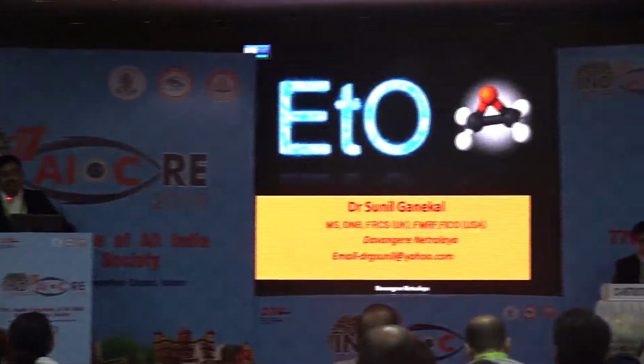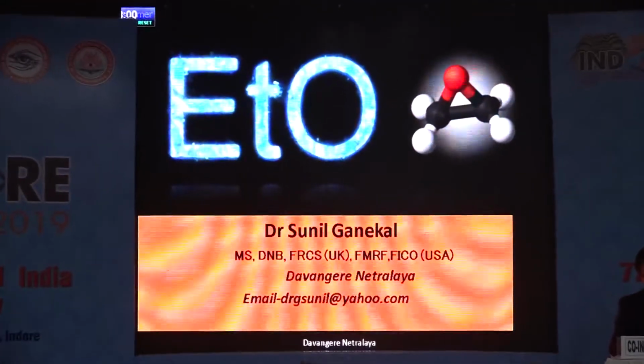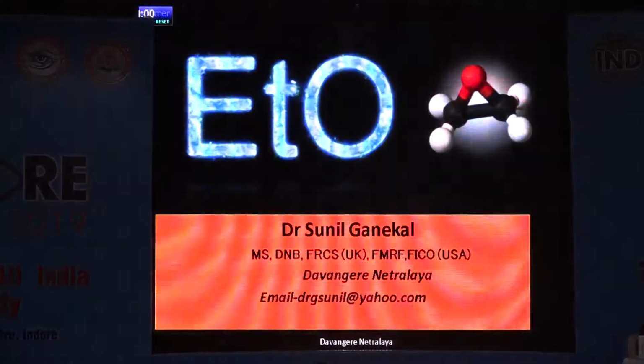So basically the commercially available options, either you can use ethylene oxide sterilization, or as Bharti told, you can go for plasma sterilization.